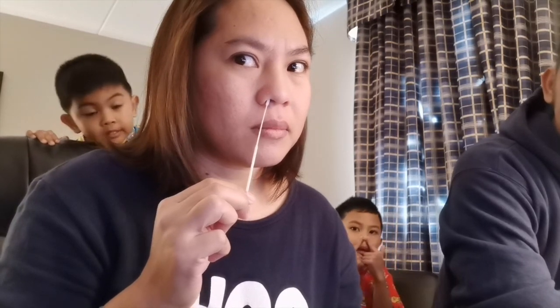And make sure you're going around the whole nostril. Ganun lang kuya, oh. Just like that lang, oh. So easy. Babaw lang, di ba? Okay, perfect. And now we're gonna do the other one for Mommy. 15 seconds. Ready?